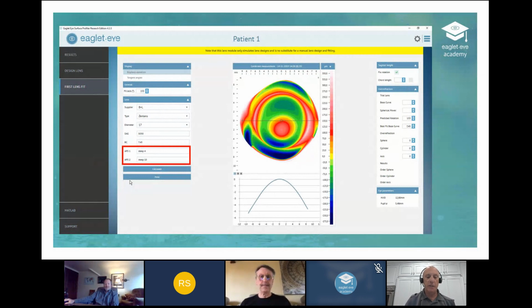In this case, this patient is steep, in this case, 4 steps, like 120 microns by steep 270 microns. So the difference is there, but everything is much steeper than I ever would have accounted for by looking at a lens. And the biggest issue for me in the past, especially in the horizontal meridian, you would sort of say, well, this looks real flat or real steep.